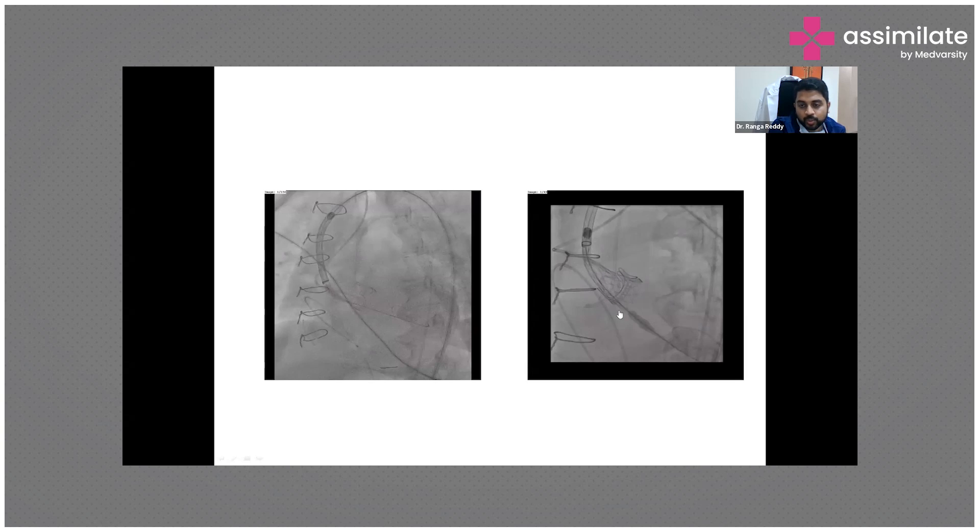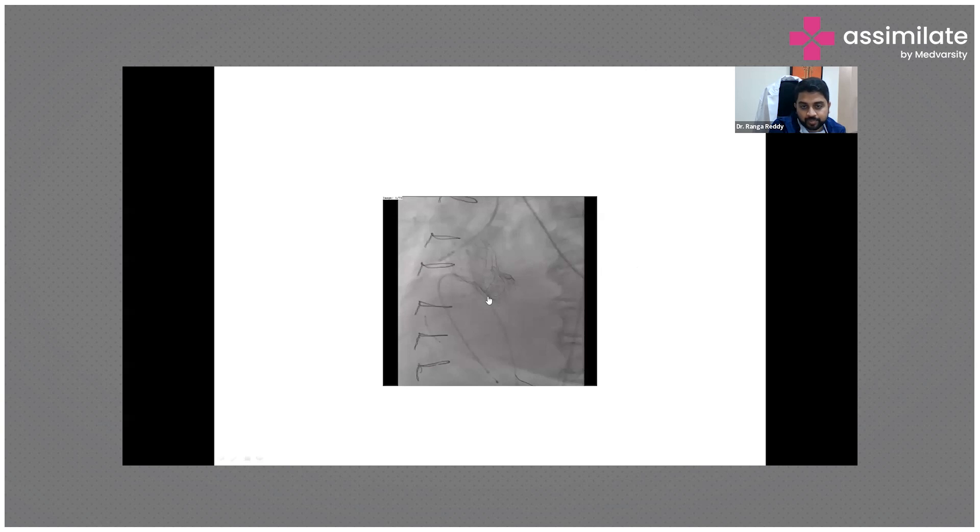You can see the self-expandable valve being deployed through the old surgical frame. This is how it looks after deployment — this is the valve-in-valve result.